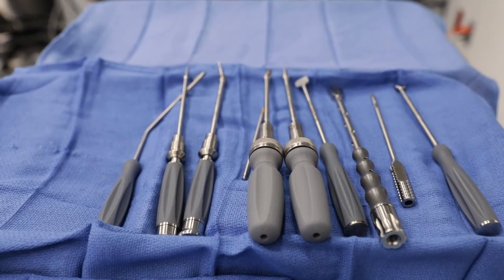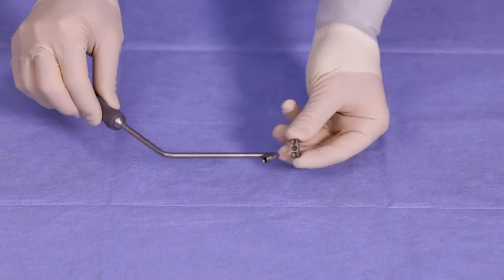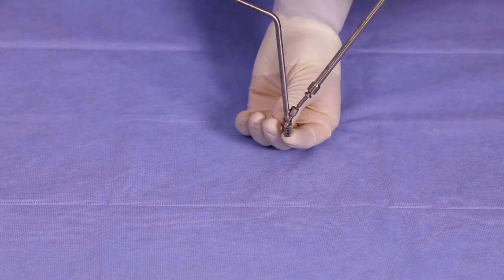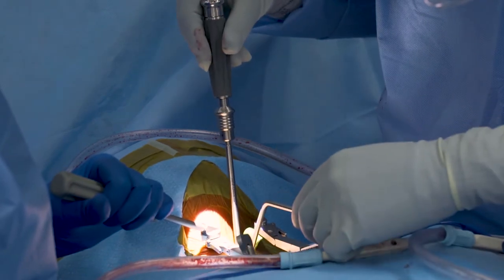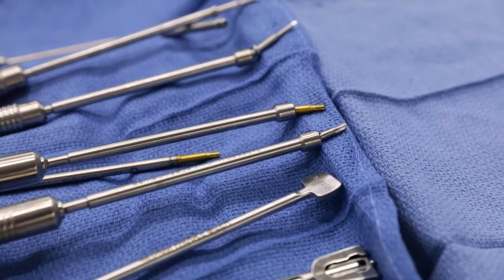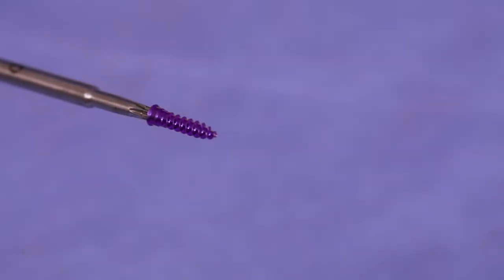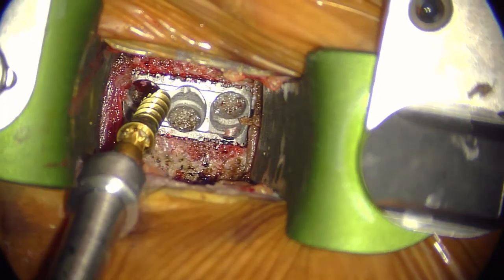For freehand placement, there are two options for awl and screw insertion. For the angled option, dock the angled awl guide in the appropriate screw hole. Now introduce the angled awl to create your pilot hole. Your screw can now be introduced by either using the angled or straight screwdriver. Select a screw and attach the screwdriver by inserting the distal end of the driver into the hexalobe head of the screw, and advance until the screw head contacts the cage and begins to resist rotation.